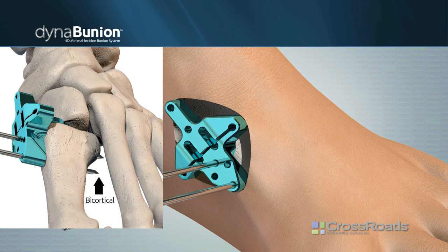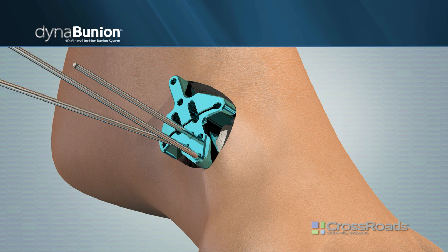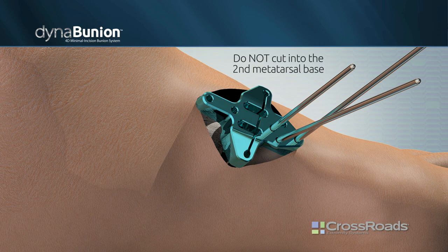To prevent the cut guide from being displaced during resection, a 2 mm wire can be placed into one of the extra holes to hold the guide in place. Utilize one of the provided extra long 40 mm saw blades to complete the metatarsal cut. Care should be taken not to cut into the second metatarsal base.